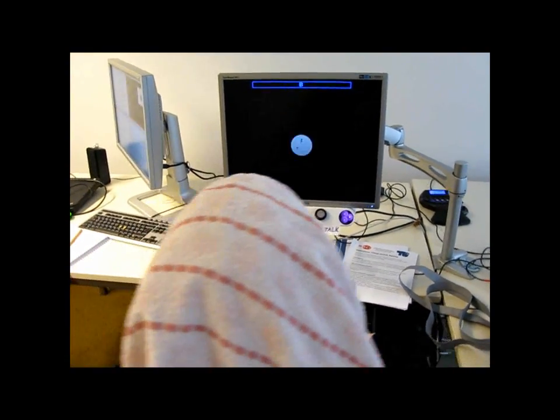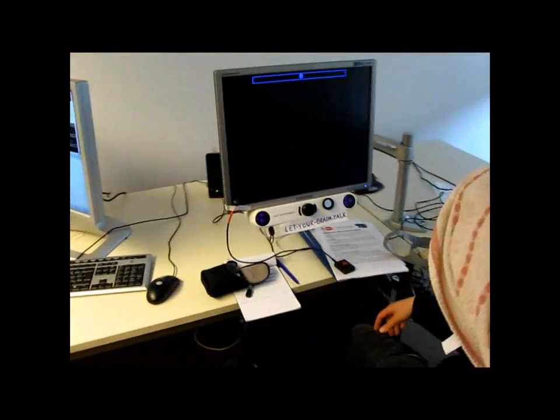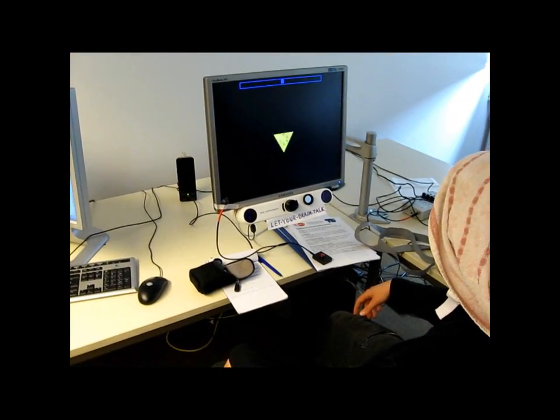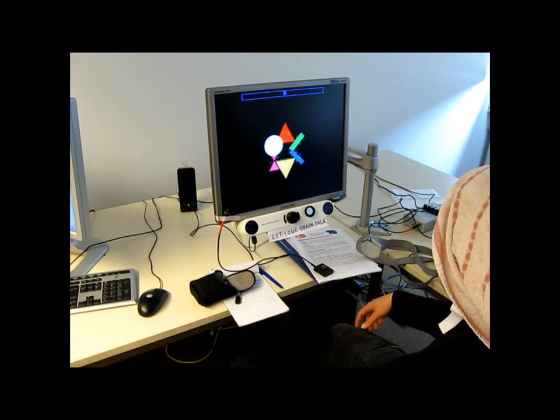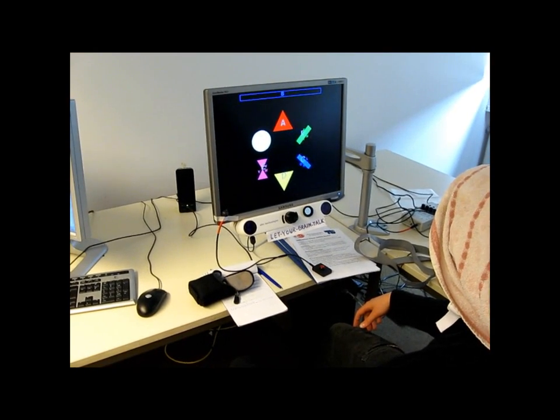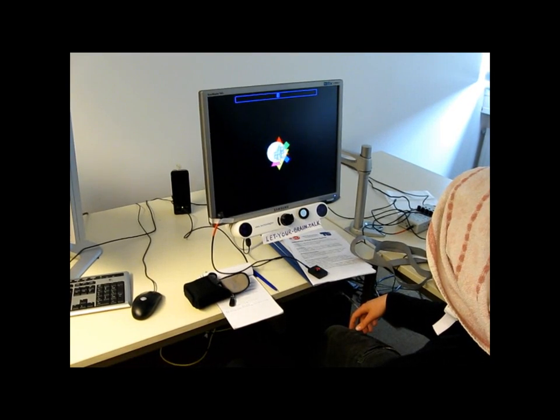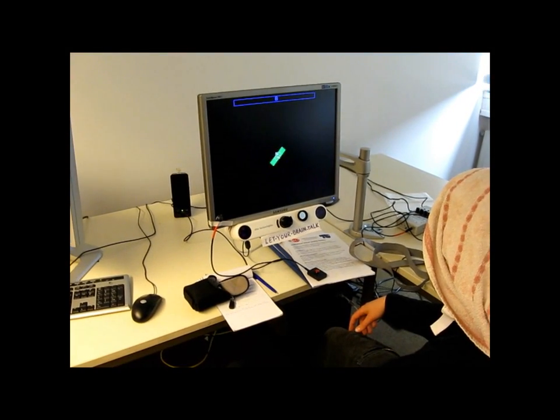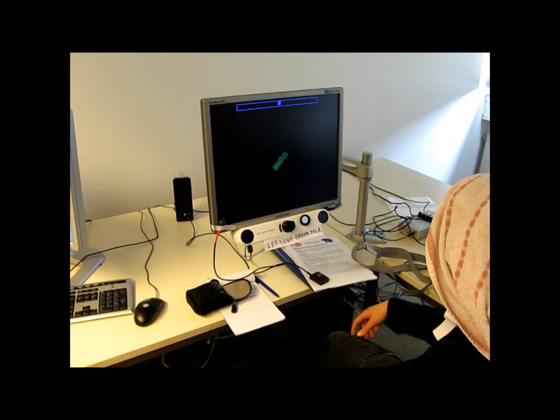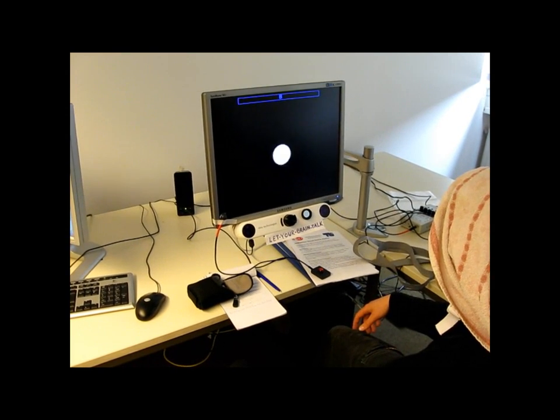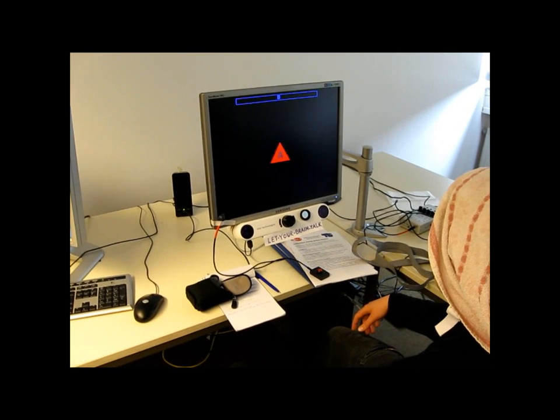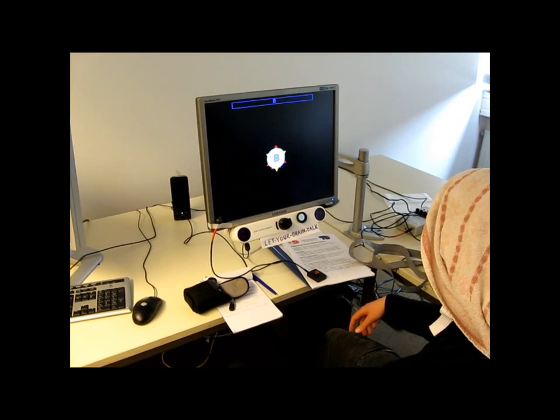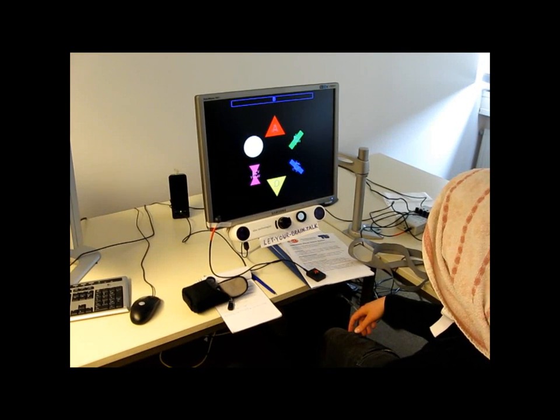Otherwise I'm completely shutting my brain down, and as you can see this happens in a very quick time. So first of all, as you saw before, you have to choose one category of letters, and then that category of letters will be narrowed down to just a few letters, where you can actually pick the actual letter. This is much easier than seeing the whole alphabet one after another, of course, and much quicker and much better.